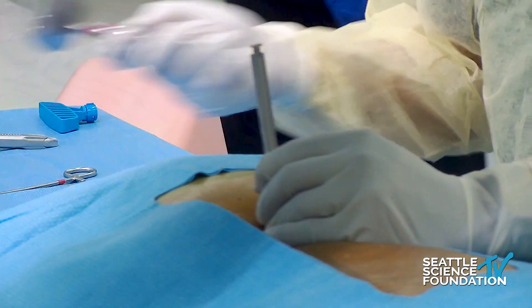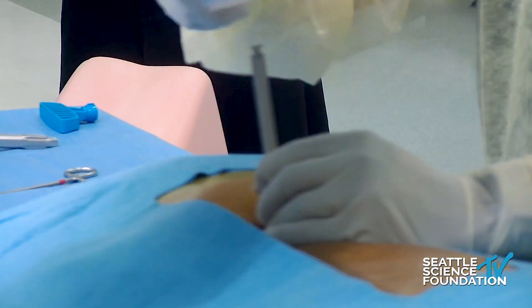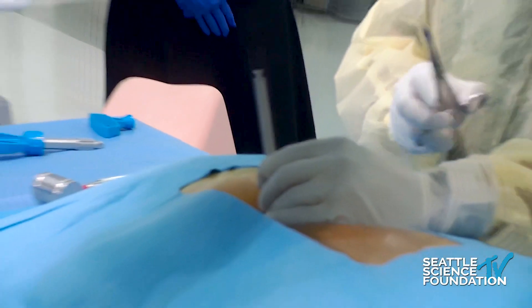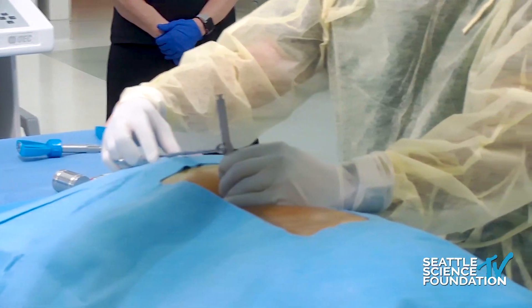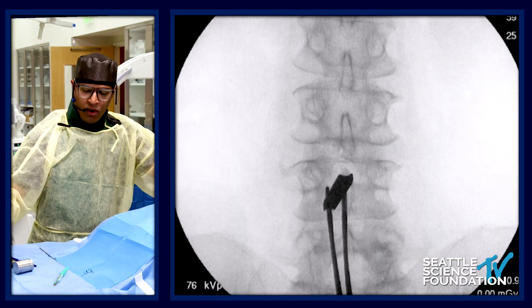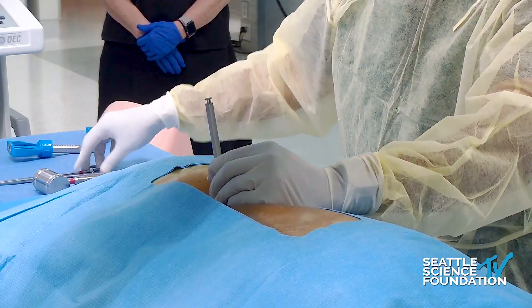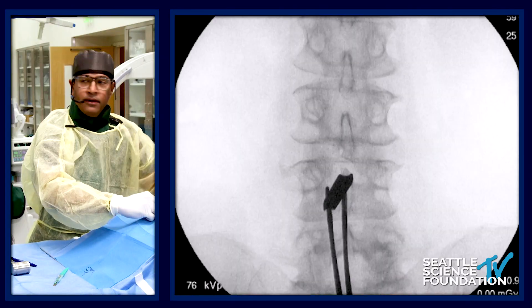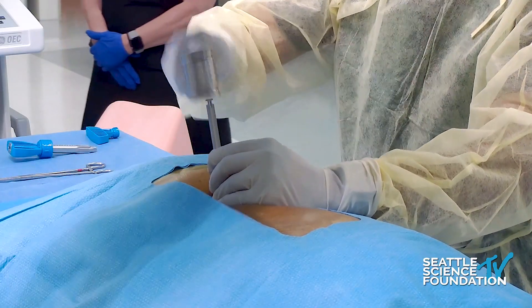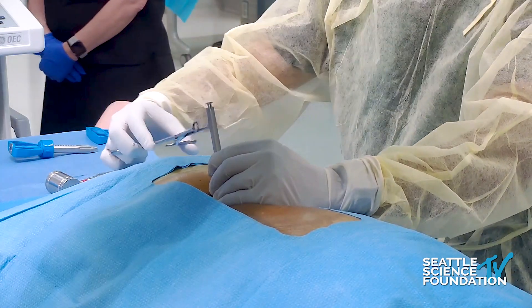The most important thing is to watch your hand. I'll use my left hand — no fluoro — mallet and advance a little bit. I can feel with my left hand that I'm advancing a millimeter or two. Then I check, because the tendency is for dilator 1 to veer off to the right or left. Mallet a little further, check. If you master this back-and-forth, it will ensure success.